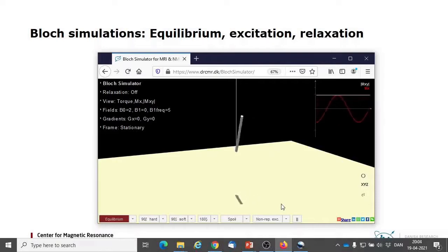You here see a magnetization vector precessing in a magnetic field. It has a longitudinal component along the direction of the B0 field, that is here vertical, and it has a transversal component in the orthogonal plane, here illustrated by the shadow on the floor.